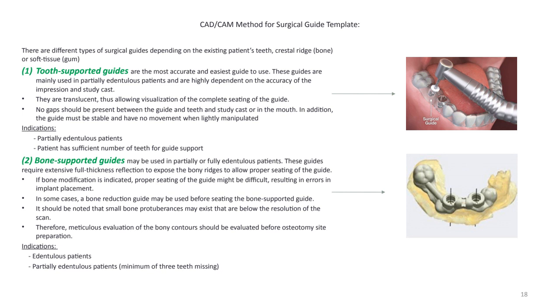There are certain practices in implantology where sometimes the doctor performs a bone reduction to flatten the surface of the crestal ridge. So the surgical guide can be bone supported, and that should give a little more stability. This is for patients who have a large edentulous area of the arch, or for patients that are already using a partial.